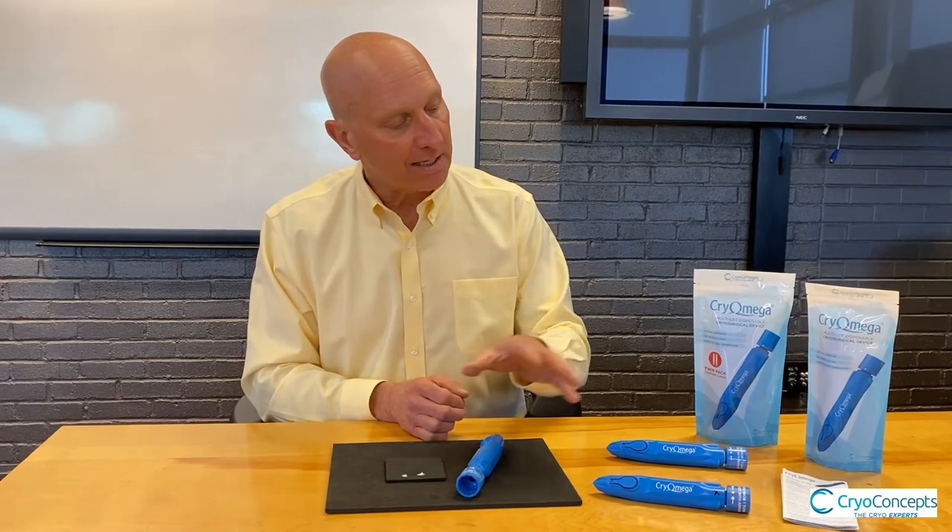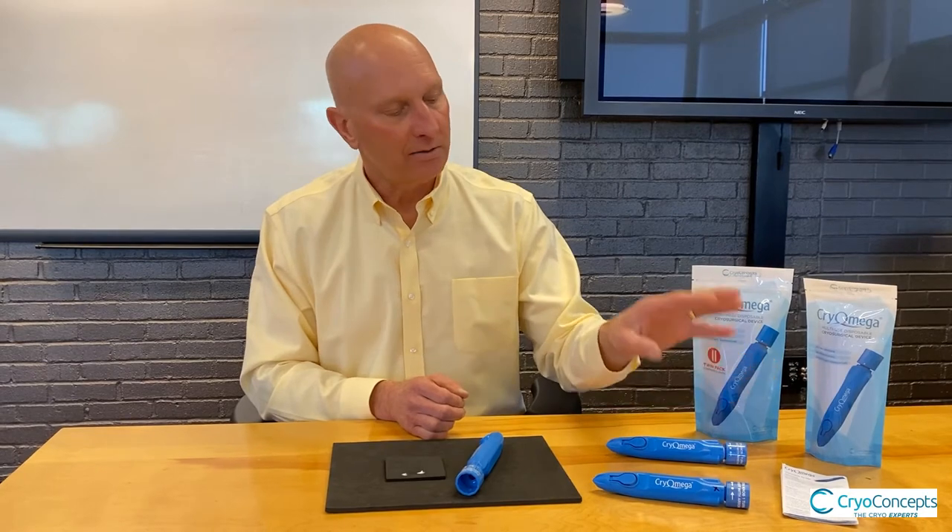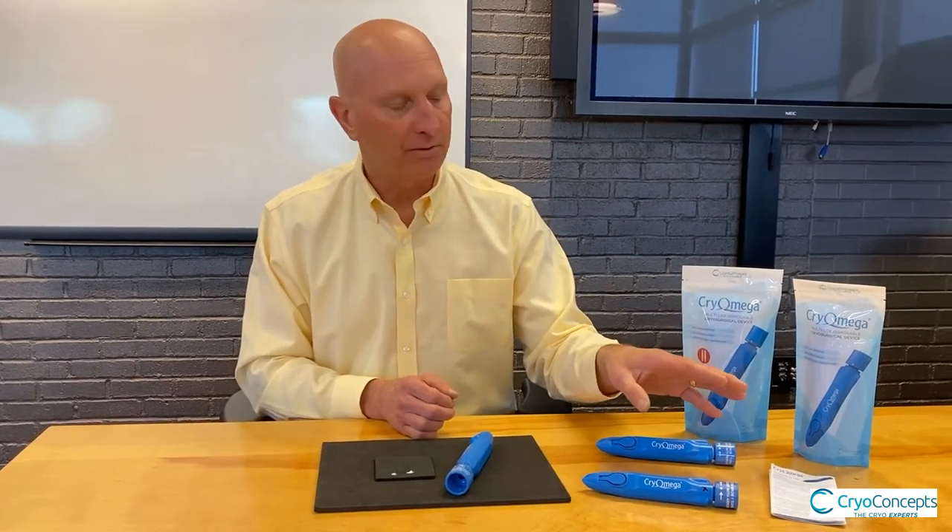Each practitioner will develop their own understanding and use of the device. At all times, I would reference you back to the package insert to make sure you read it cover to cover so that you understand all the nuances of operation as well as best practices.